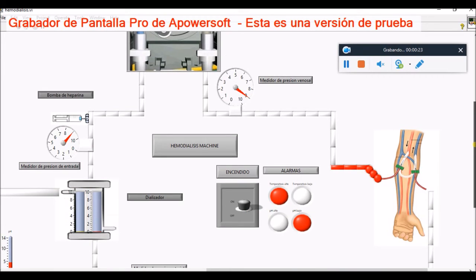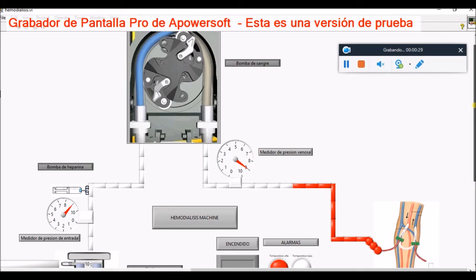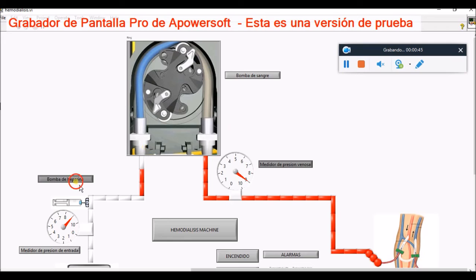Air sensors monitor the extracorporeal blood for air that may be introduced into the circuit. Bubbles may enter the system, accumulate, and break in the circuit. If air is detected, the machine will alarm and the circuit will stop automatically to prevent air from being infused into the patient.